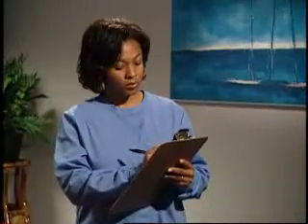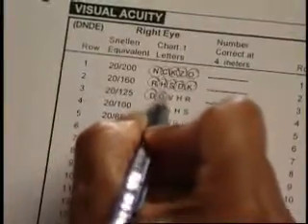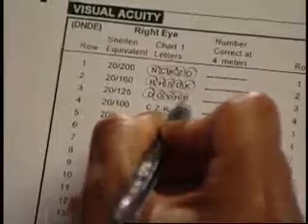As important as it is for examiners to know how to correctly administer the visual acuity exam, it is just as important for them to know how to correctly complete the case report form or visual acuity worksheet that corresponds to Charts 1 and 2. Most studies require examiners to circle the individual letters a subject reads correctly on the case report form and visual acuity worksheet, leaving the letters read incorrectly or not at all unmarked in any fashion.